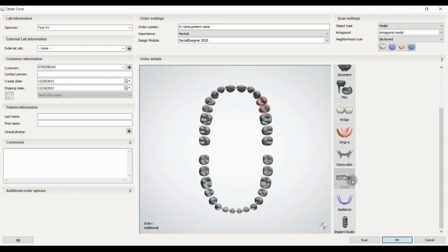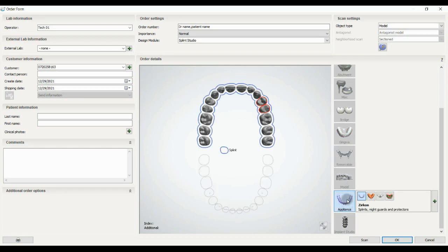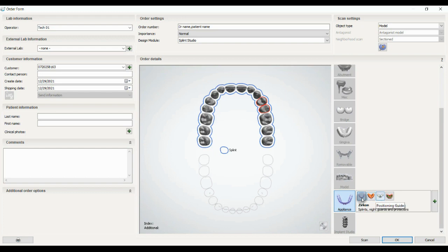The next one is appliance. In appliance you can design a splint, night guard, you can design custom impression tray, positioning jig for your abutments, and 3D bite plate or the rim for your doctor to specify the vertical dimension.